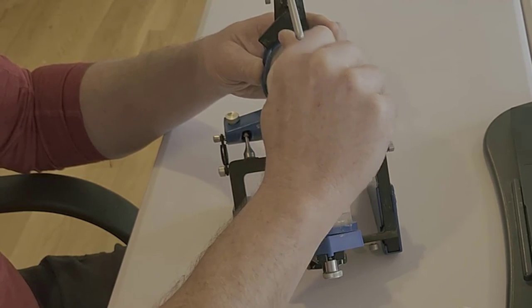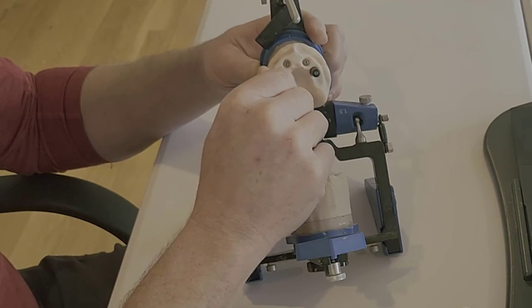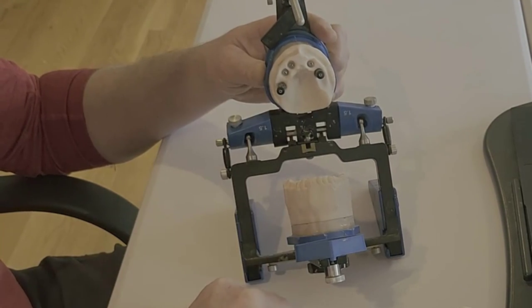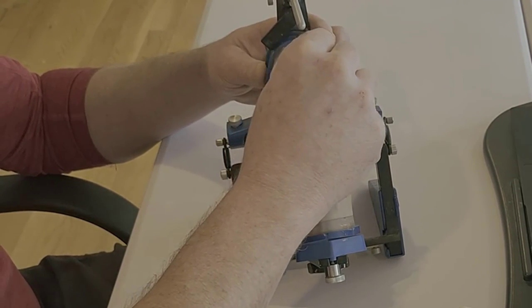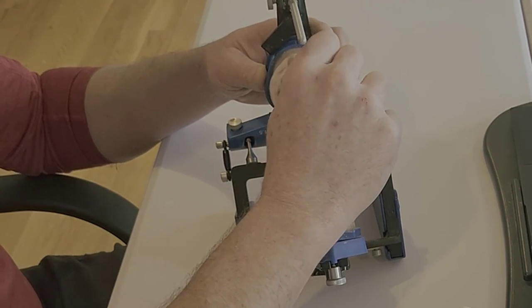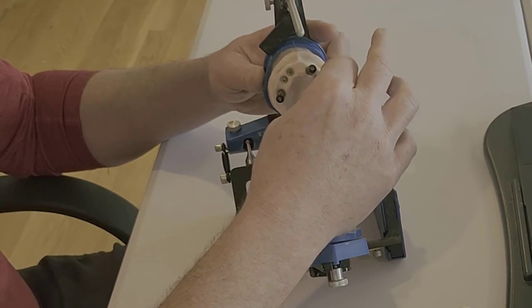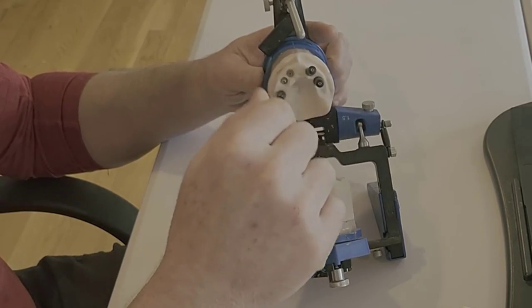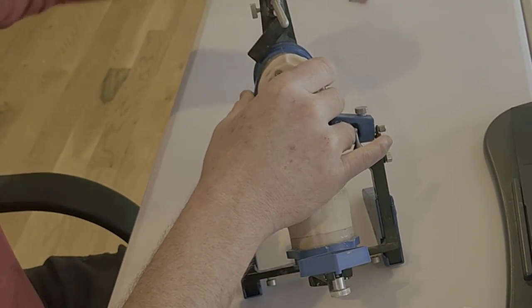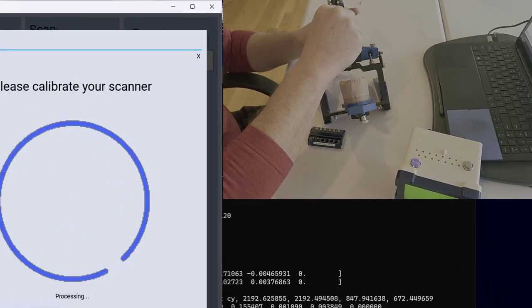And so they're pretty easy to just place by hand. Well, as I say that, I'm struggling with that one. That one went on fine, I just didn't have the right angle on it. There we go. I guess that one's at a little bit more abrupt angle than the others, but about 2 finger tight. You do have a screw head here that you could use the little included screwdriver if you want to seat them that way, but I just find it easier to use my fingers to do it.